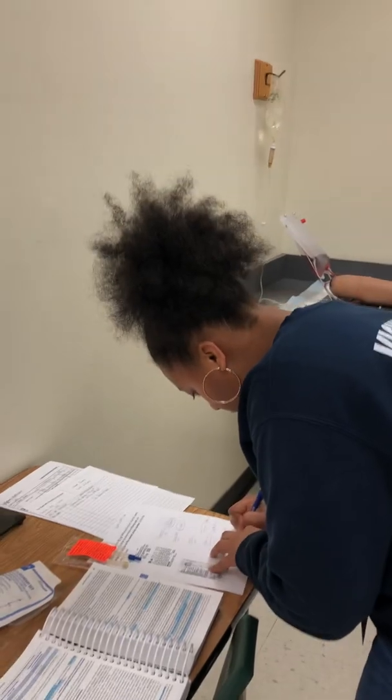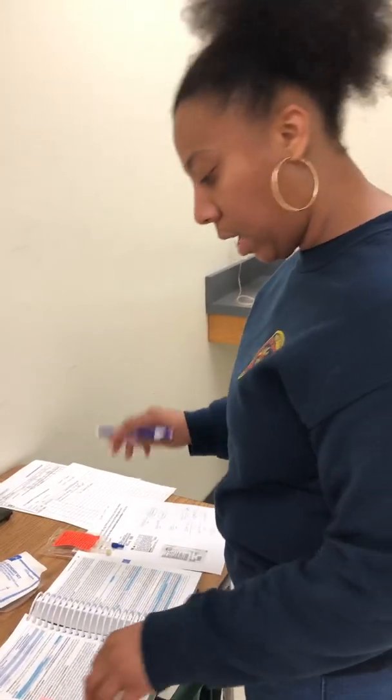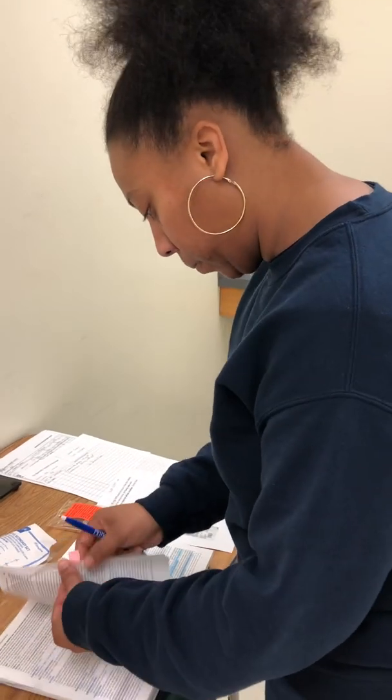And also I meant to say the medication is given between 30 to 60 minutes. So I'm going to choose to do it over 60 minutes. And that comes out to 50 milliliters an hour. Okay.